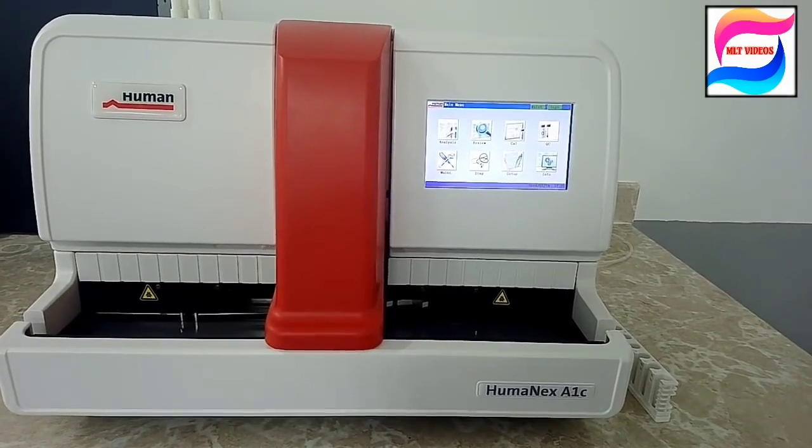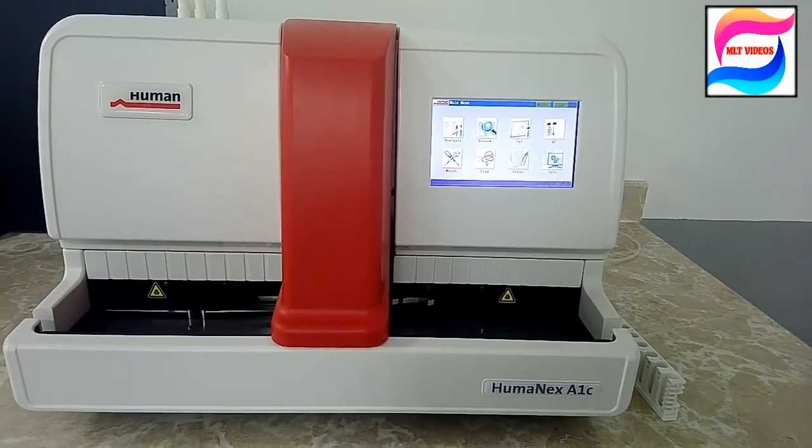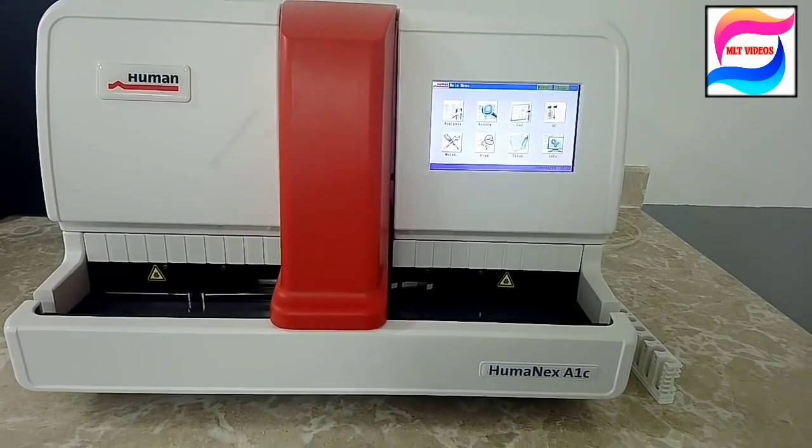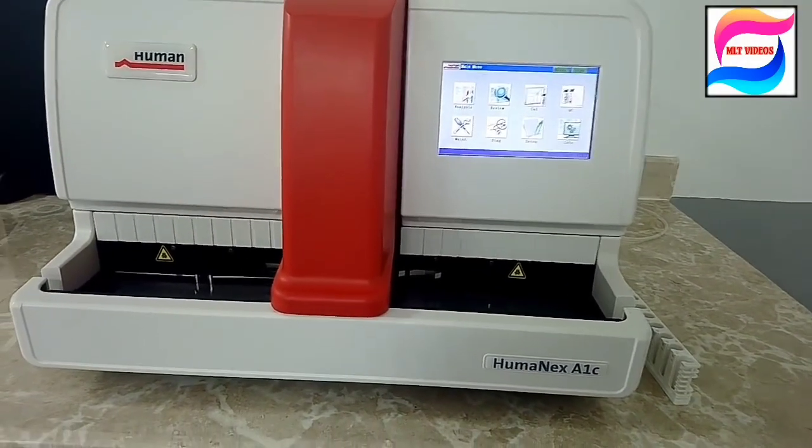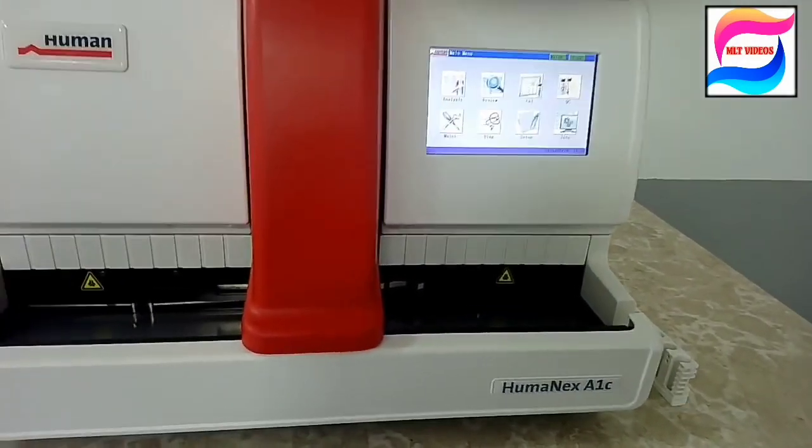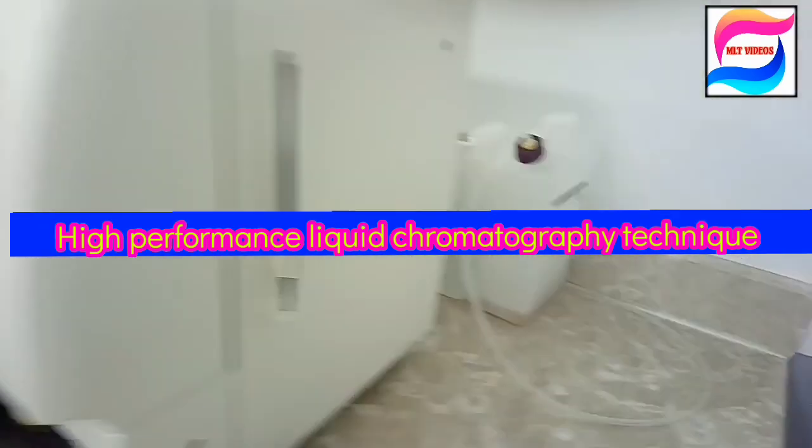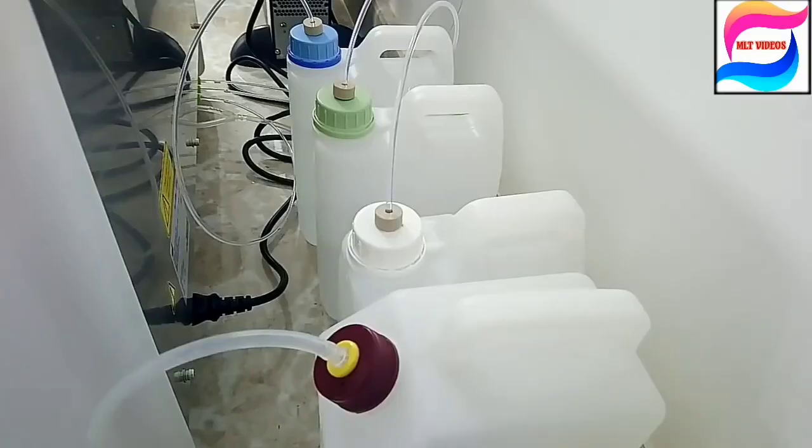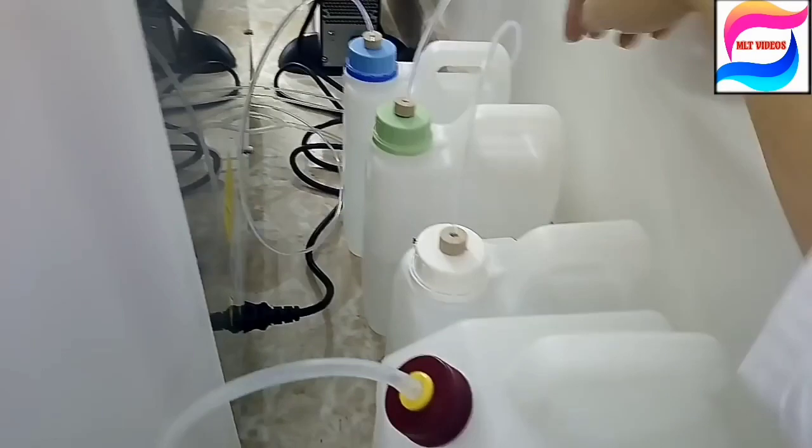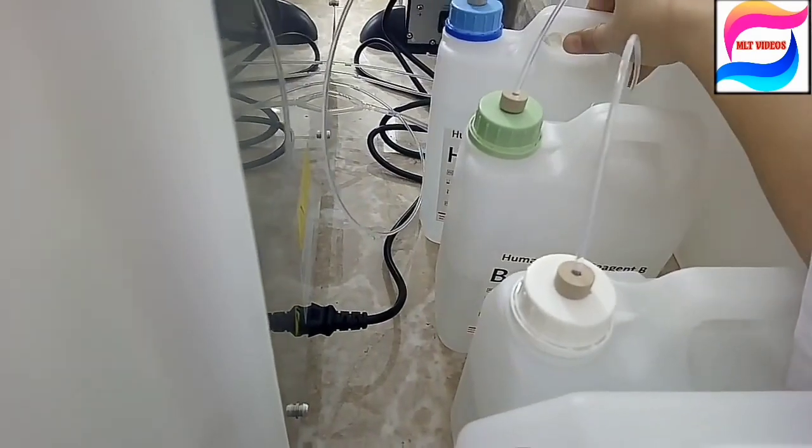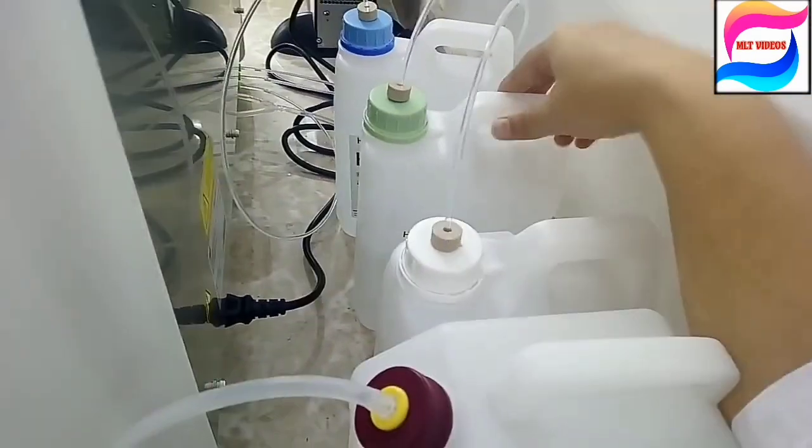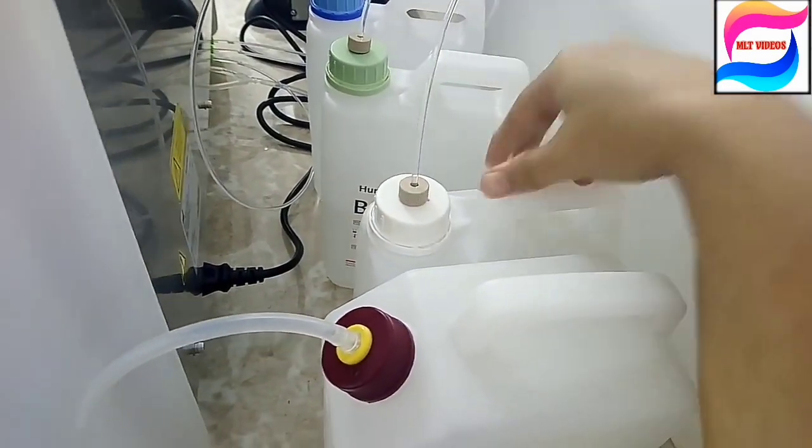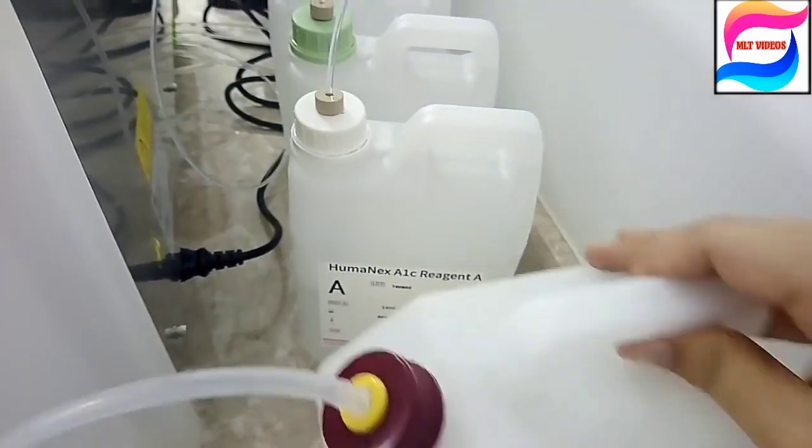So this machine is by Human company and this machine is based on the HPLC method, means high performance liquid chromatography method. First of all, what are the reagents used in this machine? There are three reagents: first is H reagent, B reagent and A reagent, and this one is for waste.